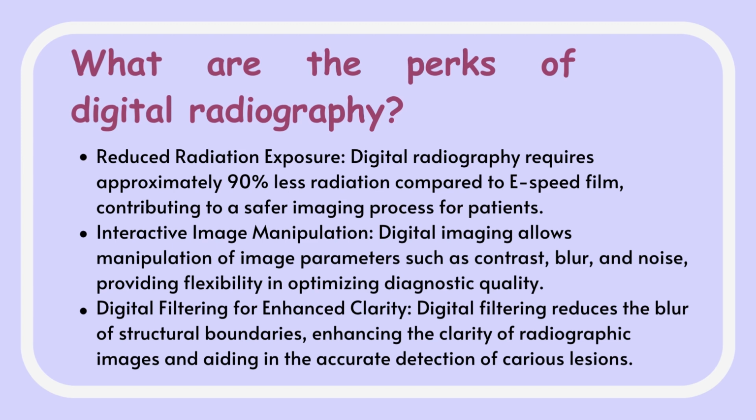Digital imaging allows manipulation of image parameters such as contrast, blur, and noise, providing flexibility in optimizing diagnostic quality. Digital filtering for enhanced clarity: digital filtering reduces the blur of structural boundaries, enhancing the clarity of radiograph images and aiding in the accurate detection of carious lesions.